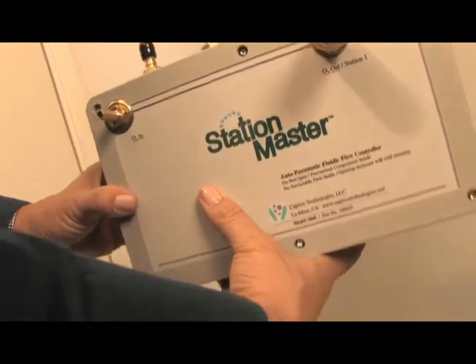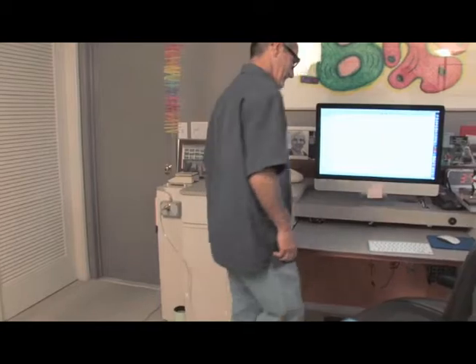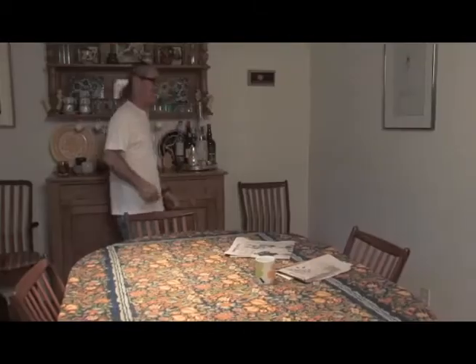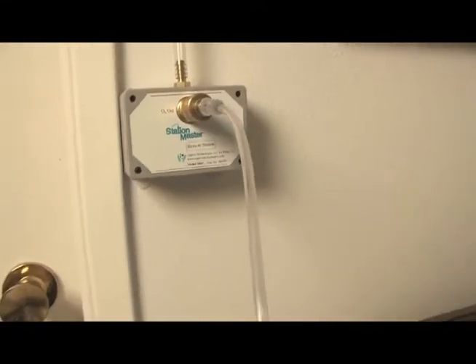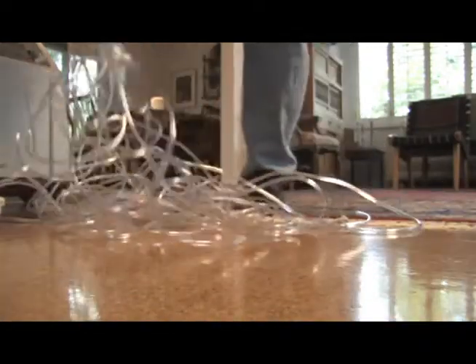Hi, I'm Kathy Norse, registered nurse and part of the development team that created the StationMaster, a wonderful new product that lets oxygen users freely move about their home once again. StationMaster is the multi-outlet home oxygen distribution system that ends tubing tangle forever. It helps prevent accidental injury from tripping on loose tubing and stops tangles and crimps that impede oxygen flow.